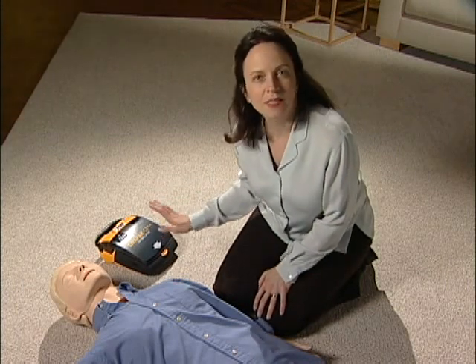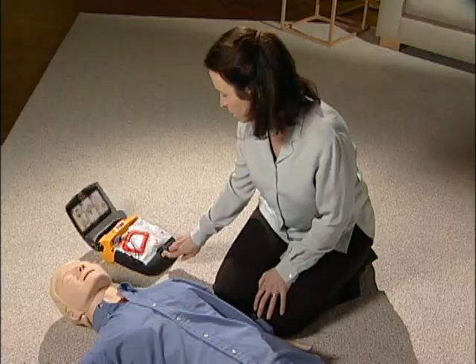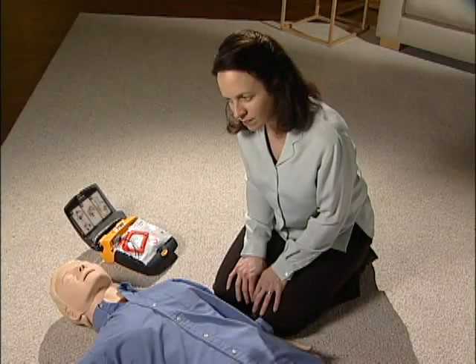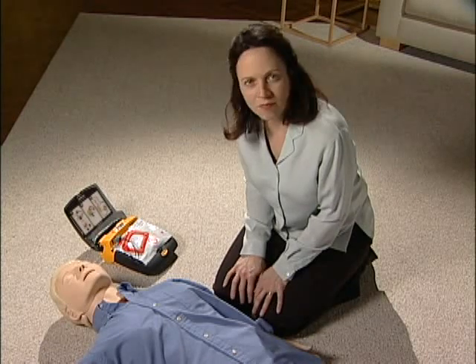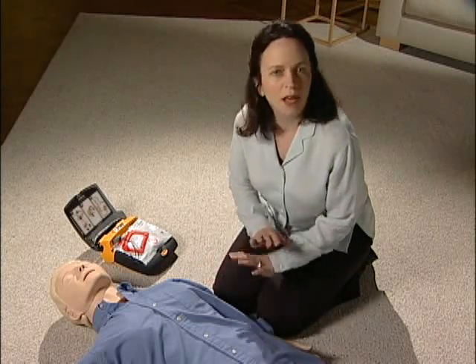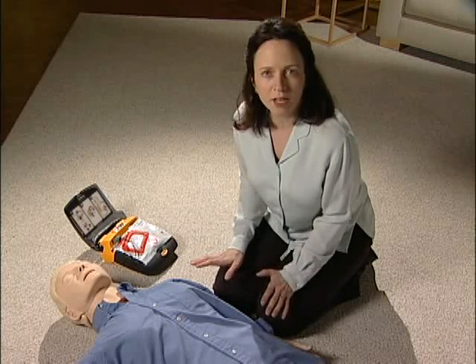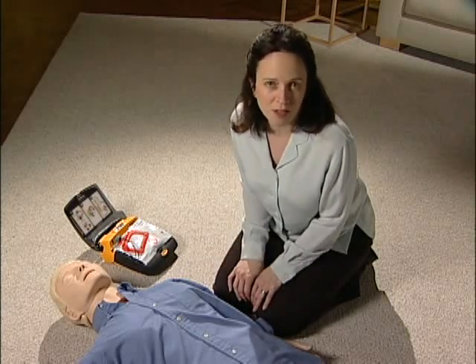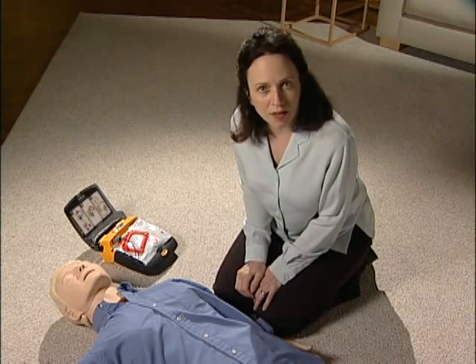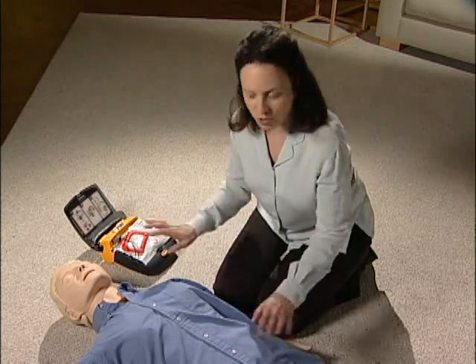Set the LifePak AED on the same side of the patient as you. Press the on-off button. The device will say: 'Call for help now. Remove all clothing from patient's chest.' You've already called 911, so start getting the clothes off their chest. Do whatever you have to do to clear the clothing quickly — lift it, tear it, or cut it off. Don't waste time being nice to the clothes. Some versions of the LifePak AED come with a kit that has a pair of scissors, but the fastest way is often to just tear open the shirt.